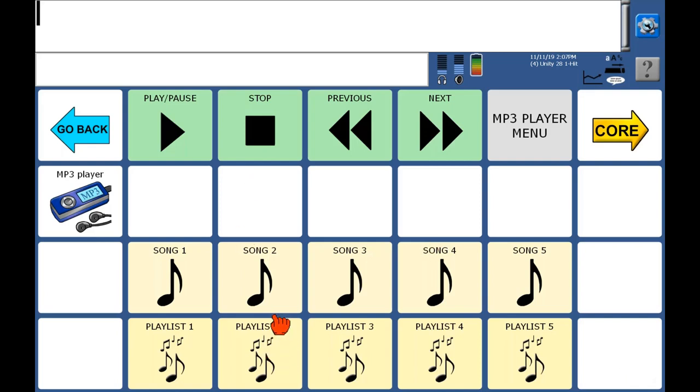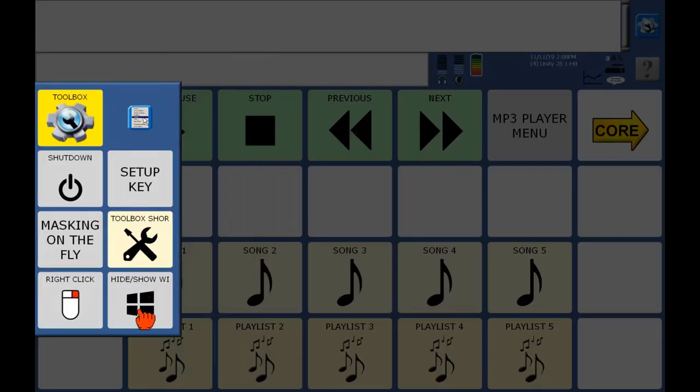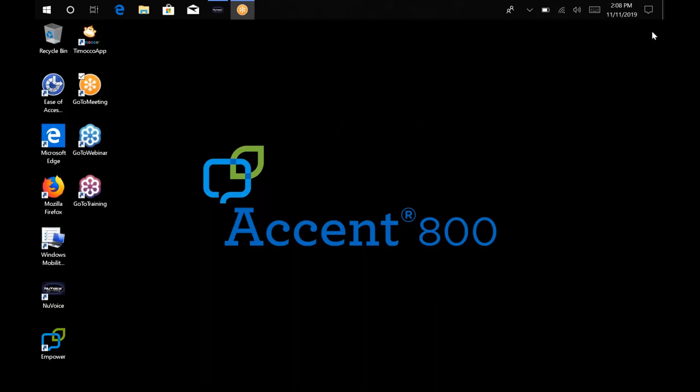And I see my command there. Say OK again. So now I'm going to pull my USB out of my device. You should hear a little ding that lets you know I pulled it out. And so now I can hit playlist 2 and it will play just directly from the Accent. I can skip through all my different songs here. Okay, so it's playing all the songs in my list. So that should hopefully do it. And that's how we're going to play MP3s.